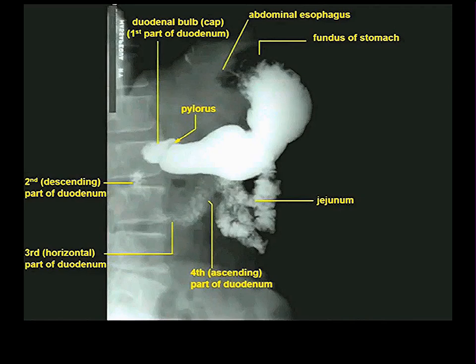If you want to do studies of the abdomen for other reasons, you have to have them swallow barium so you can see what's going on. It's still done from time to time, especially if you have an issue of transport, how fast things are moving through the bowel. You may have them swallow barium and just track it as it gets transported down and give you a sense of the time of things. Otherwise, as you'll see, everything's done with CT.